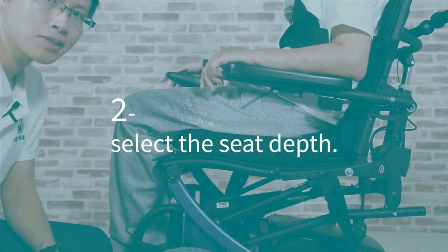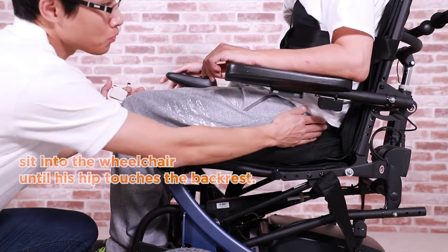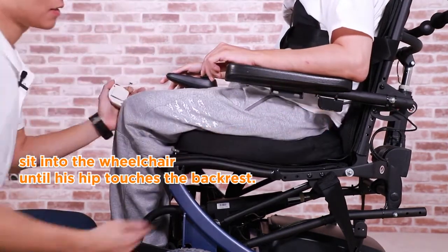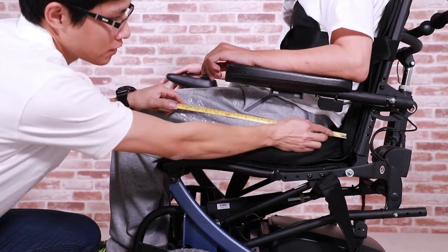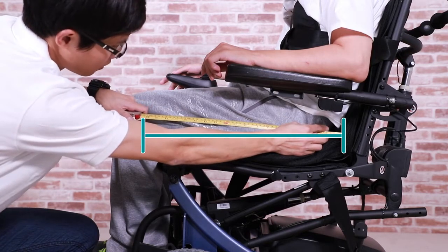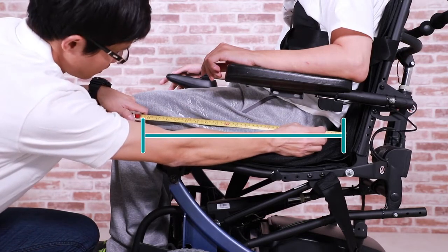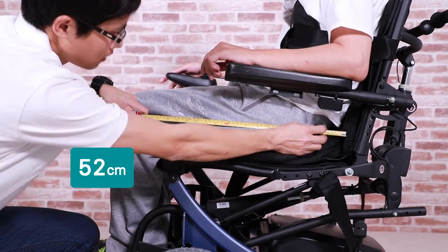Secondly, we need to select the seat depth. First, ask the user to sit into the wheelchair until his hip touches the backrest. Now, we measure the length of the thigh, from the back of the hip to the back of the knee. From this, we find that Mr. Zhang's dimension is 52 centimeters.